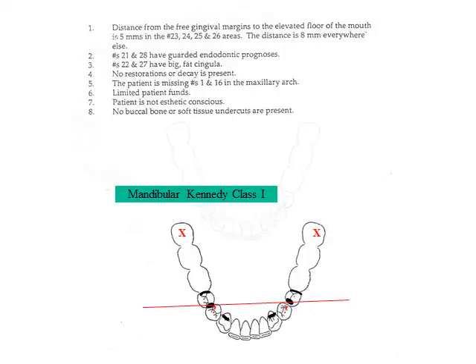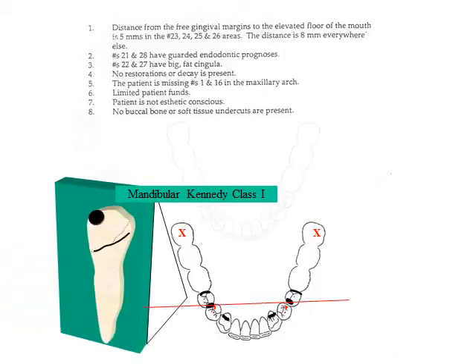Heights of contour of the clasp supporting abutment teeth should always be adjusted so that the height of contour will be found in the middle 1/3. Heights of contour in the occlusal 1/3 interfere with optimal clasp placement. The inset demonstrates tooth surfaces marked in red which should be gently reduced to reposition the height of contour.